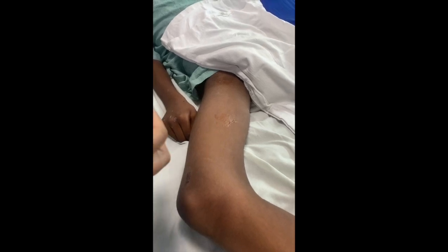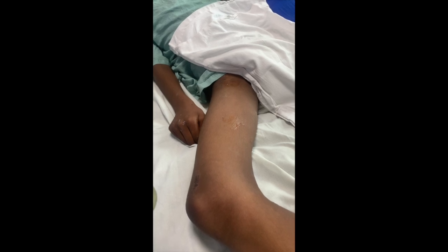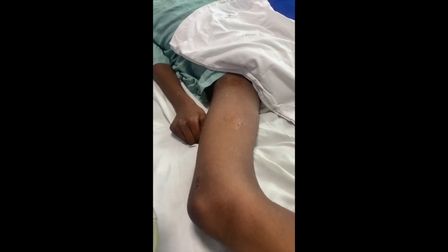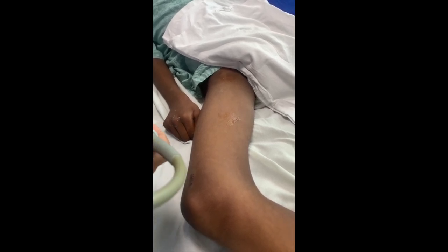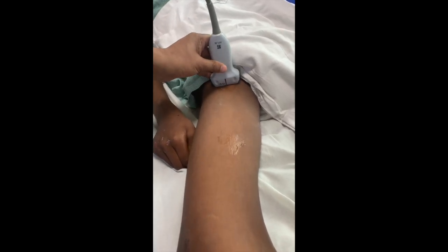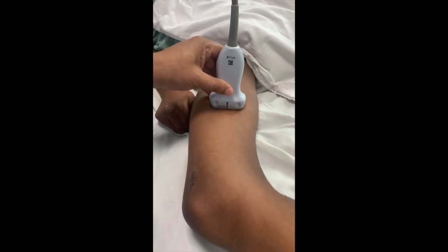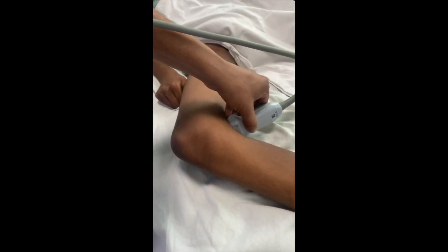In this patient, we are going to assess for deep vein thrombosis. To diagnose DVT, we have to assess for thrombus at three sites: first at the inguinal crease level, second over the mid-thigh, and third in the popliteal crease.